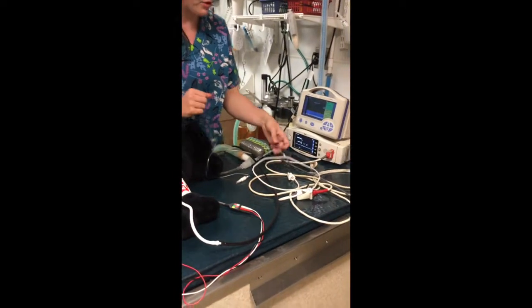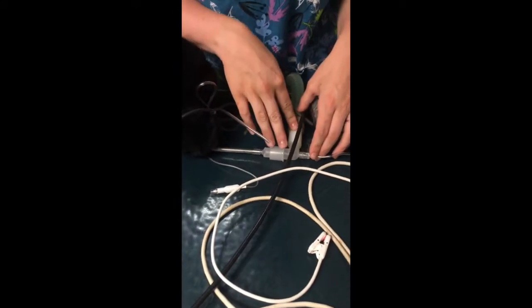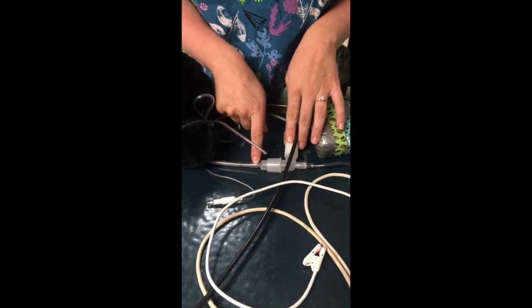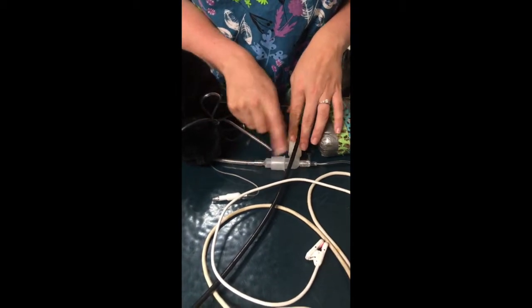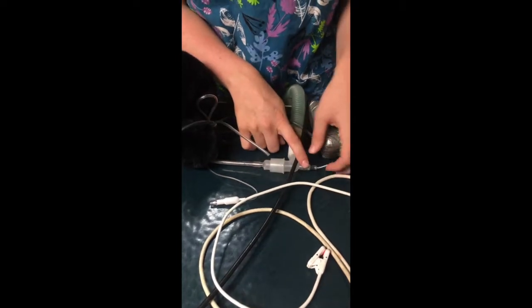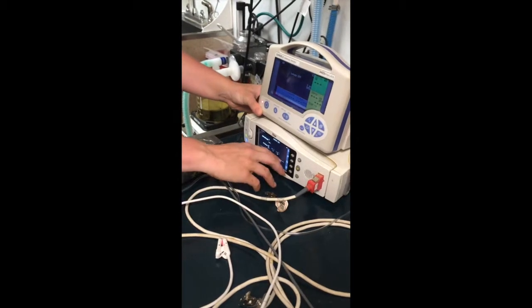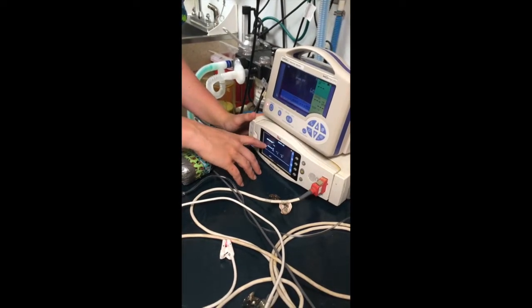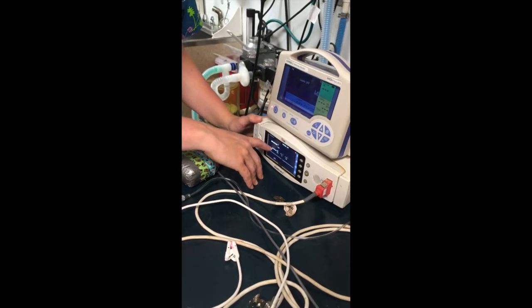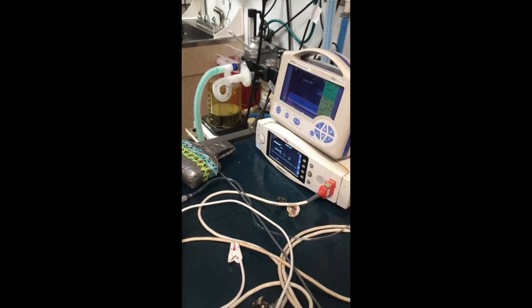Next, we have our capnograph. So our capnograph is hooked to our tube from our anesthetic machine, which is hooked to our endotracheal tube. So it's measuring the CO2 output that's coming from the patient. When you measure this, you're going to see a waveform on your machine, and the top of the waveform is measuring the exhalation point of the CO2.